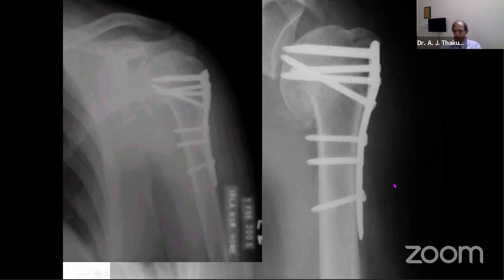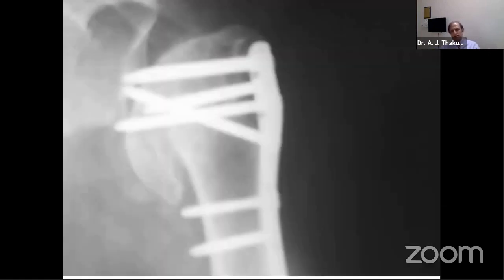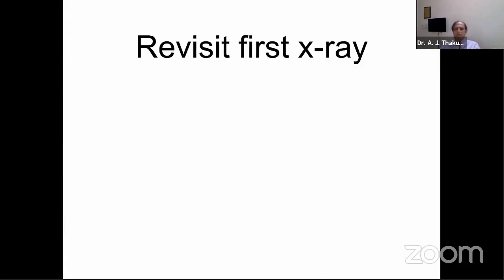The head started collapsing, and in a couple of months there was total collapse, causing a lot of symptoms and required removal of the implant. There we are. So why did this happen?